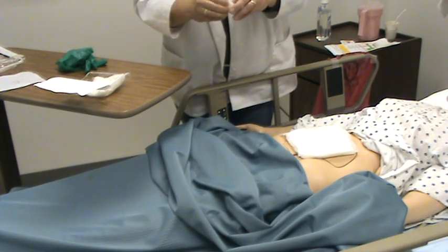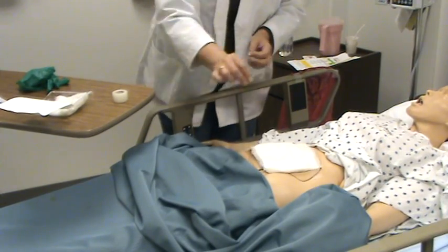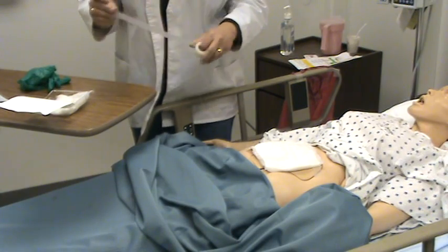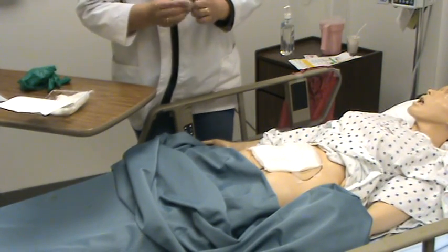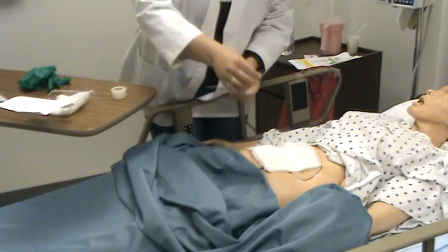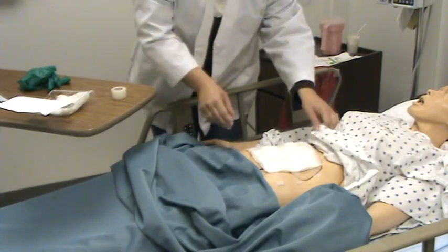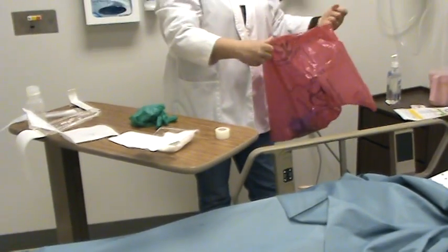The one thing I didn't incorporate because of time constraints is the culture. When I would do that is after I have wiped the sides and assessed my wound, I would go ahead and take the culture of the wound and make sure I get everything labeled and send it off to lab. Make sure you incorporate that with your dressing change. Also make sure you check your Mosby — there's a lot of good information on there. When I'm done, I would go ahead and chart the type, amount, color, odor on the dressing, and make sure the skin integrity, the wound itself, all the measurements, and how the patient tolerated it are documented. Then go ahead and do all of your post steps and clean up, take the biohazard bag to the biohazard bag room. And that sums it up.